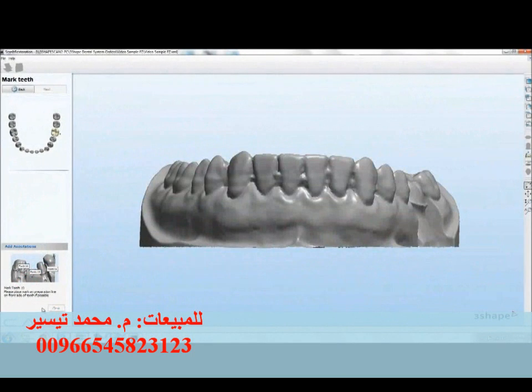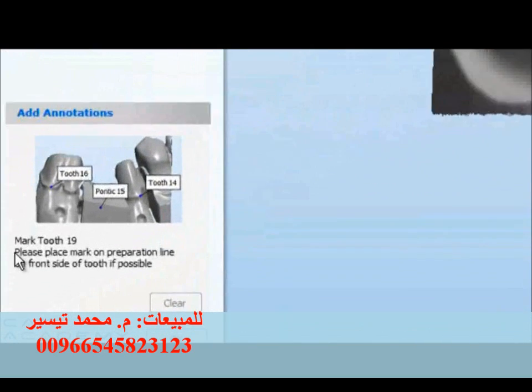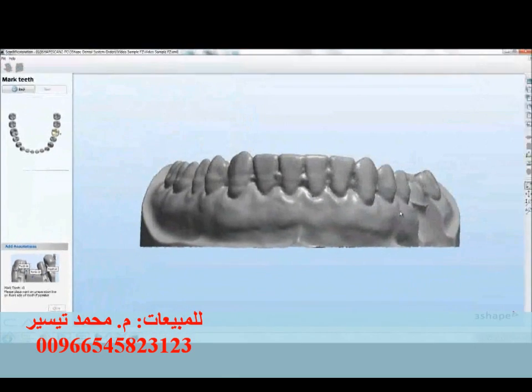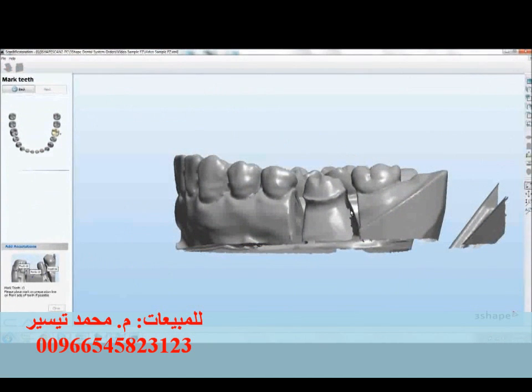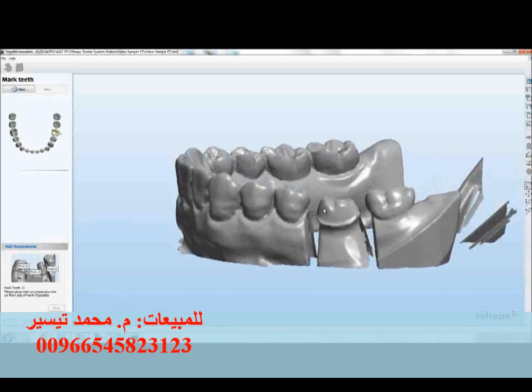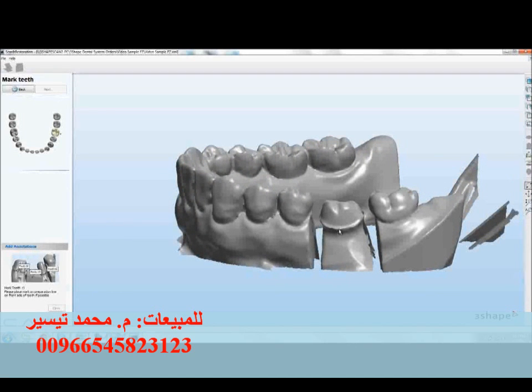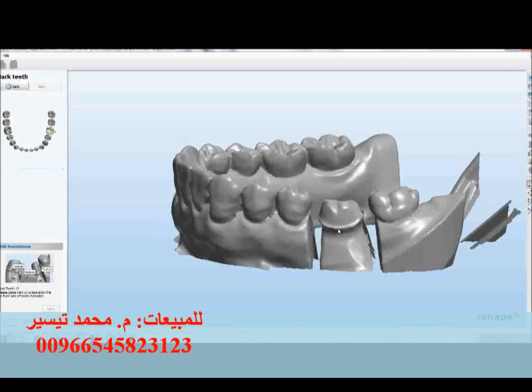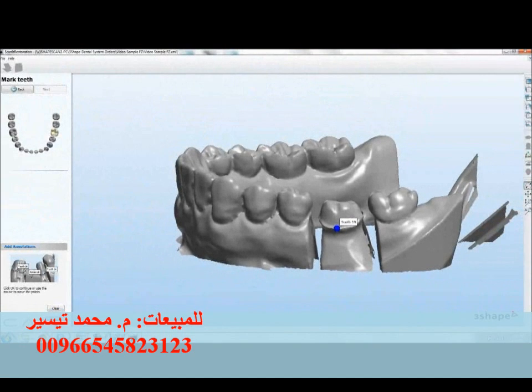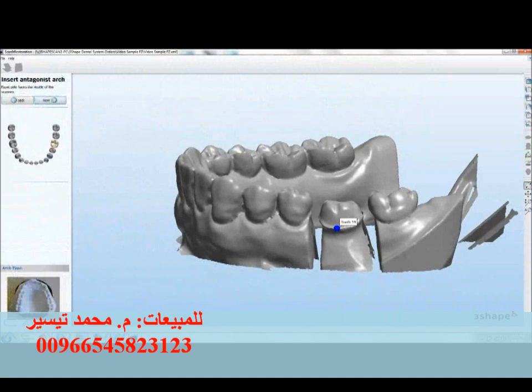Now that this case is scanned, we're being asked to mark the teeth. Specifically, the instructions are to mark tooth number 19. We're just going to rotate the case using the right mouse click, move the case so we can see the buccal aspect of number 19, and place a point using the left mouse button to mark tooth number 19 on the buccal margin. Now we'll hit OK and move on to the next step.